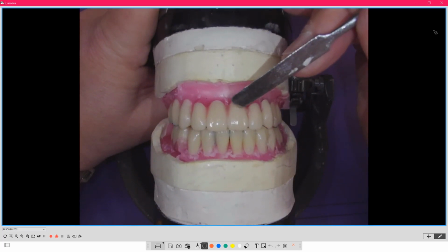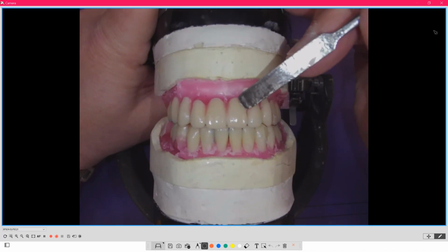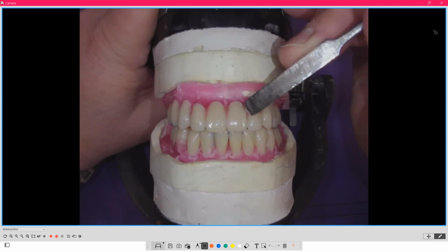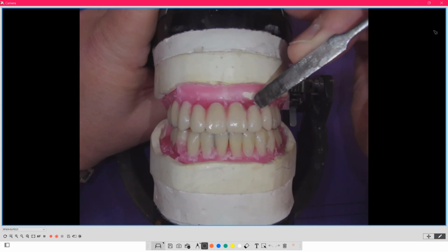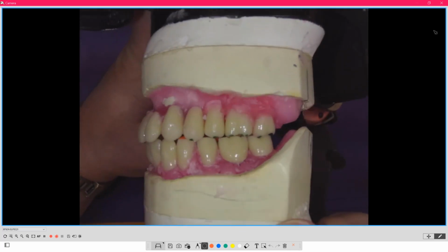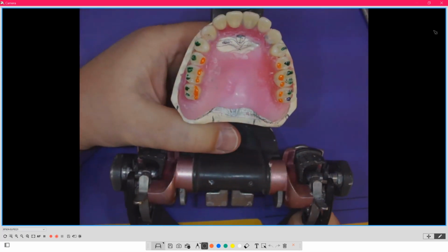And then when we do wax ups, depending on the patient, because there's no neck, I'm able to draw the wax where I want, and I can shape it to alter the aesthetics of the tooth. So instead of the tooth dictating it for me, I'm dictating it. I'm in control, not the tooth. And that's the beauty of this, is that I can then modify the wax setup better to the patient, with less interdental papilla, and such for that specific person. So again, you don't have a knuckle tight setup. It's more open.